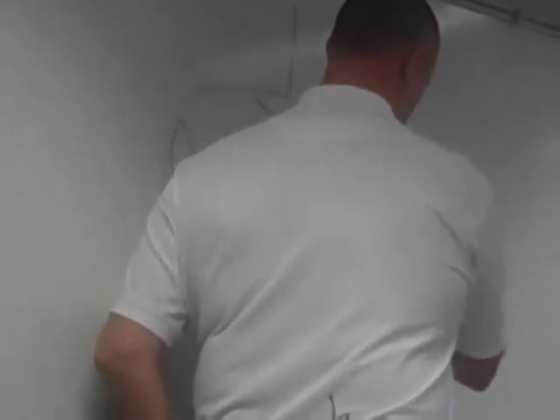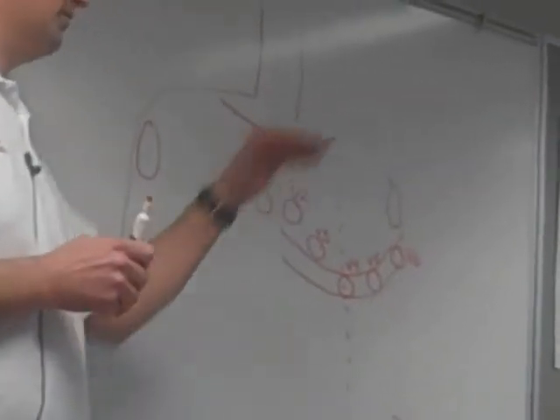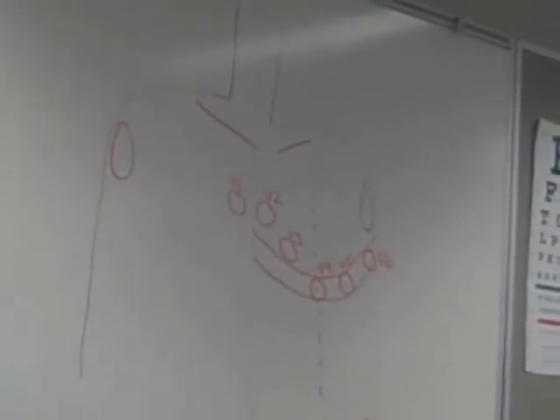That should be proper lead placement for performing a 12 lead. Remember we talked about AVR a little bit. AVR is not a lead that we use in our groups of leads. It's just kind of there by itself. If all your leads are correctly placed, everything in AVR will be upside down. Upside down P waves, upside down QRSs, upside down T waves. That lets us know that our leads are correctly placed.